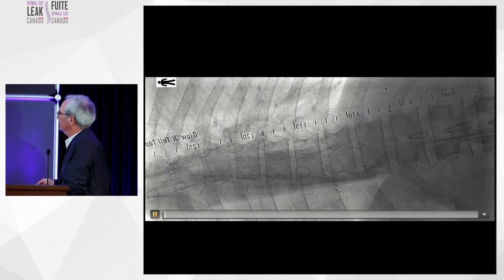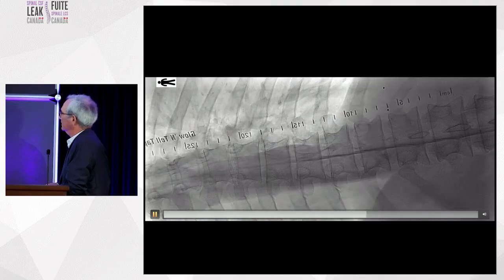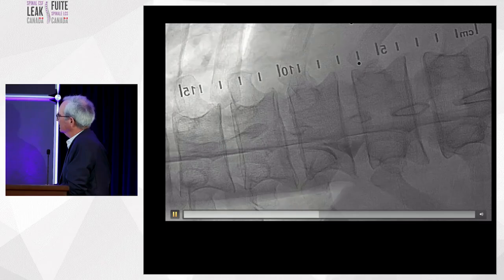We just rotate the patient with the needle still in into the left lateral decubitus, and do another injection of another 3 or 4 cc's of contrast material, and you can see the type 2 leak is starting to pool here. With a little bit more watching, you can see that the contrast material gets out of that herniated arachnoid and actually has a tear, and it starts getting into the epidural space and traveling north within the spinal canal.